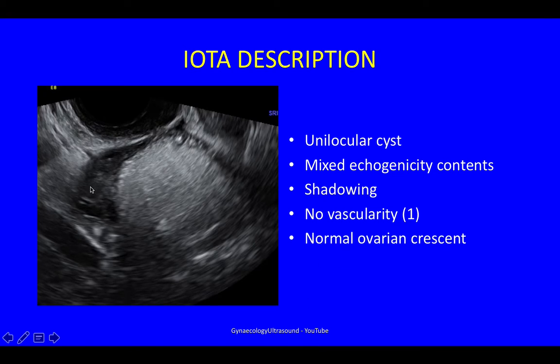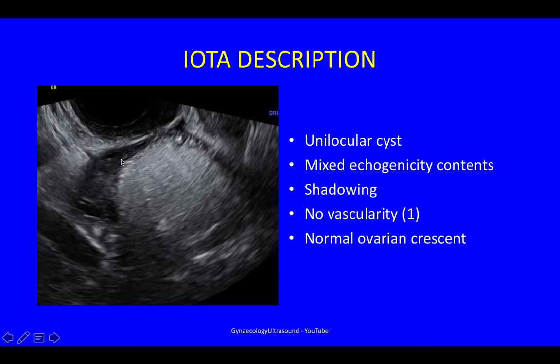Here you can see normal ovary at the edge. This is a unilocular lesion — one locule containing cyst contents which are mixed in echogenicity, which was more obvious in the video. You can see some little lines here in the cyst. There was no vascularity on the previous image using the correct Doppler settings, and some normal ovary at the edge. You can see shadowing here behind the cyst, which again was more obvious on the video image.